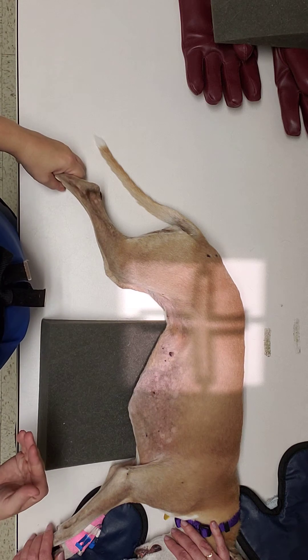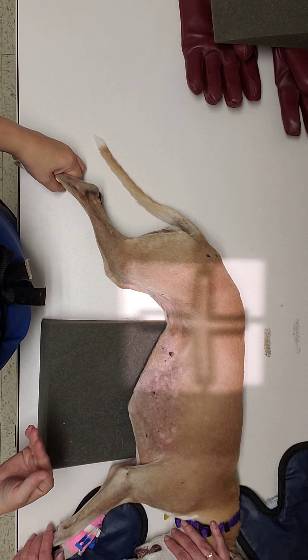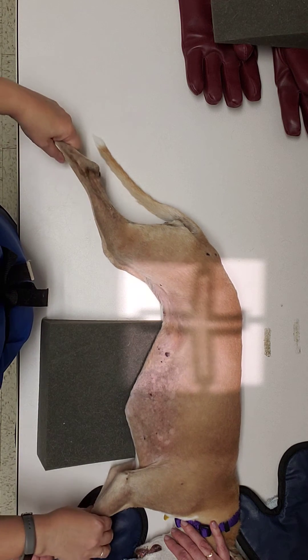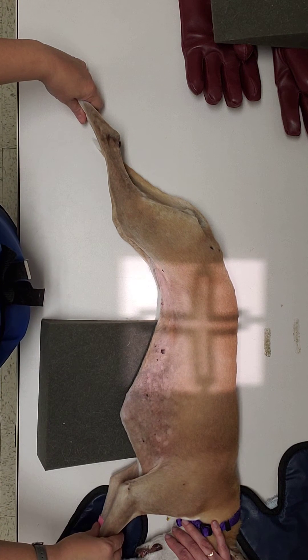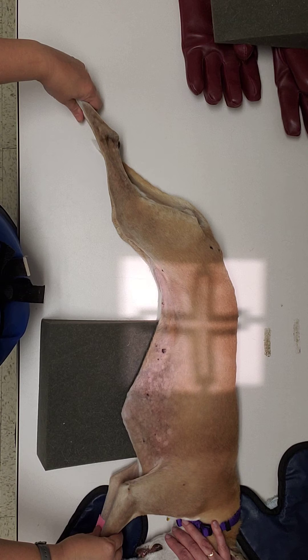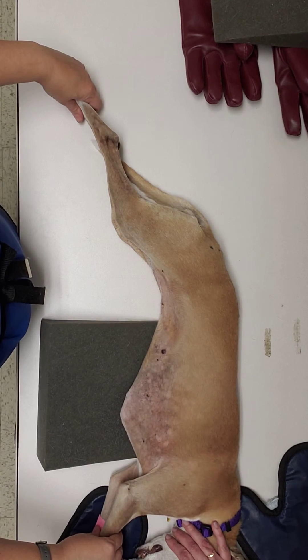You're going to want to make sure that you take the radiograph on full expiration. And you're still going to want to extend her legs forward and backwards, depending on whether it's your front legs or back legs that you're handling. She's actually in her proper position for an abdominal radiograph.